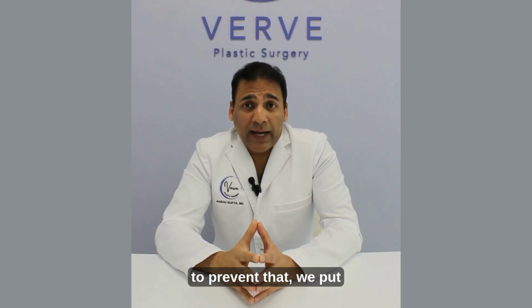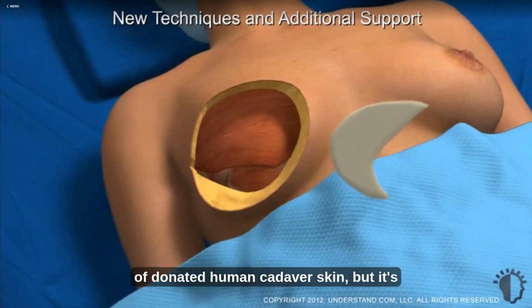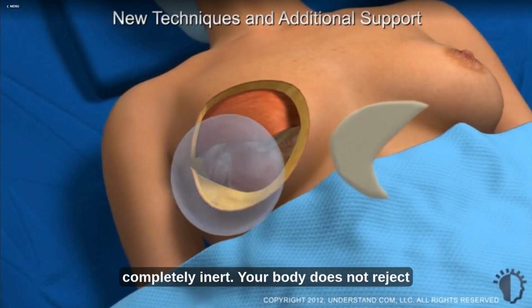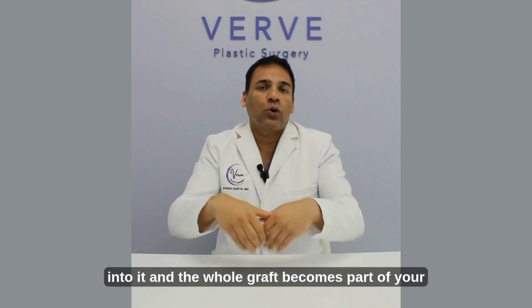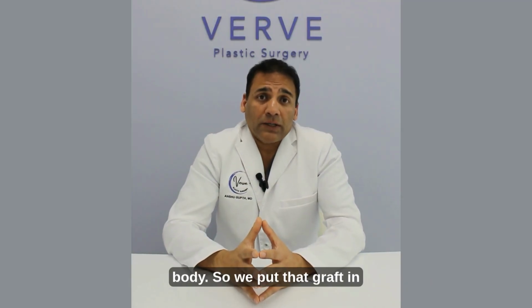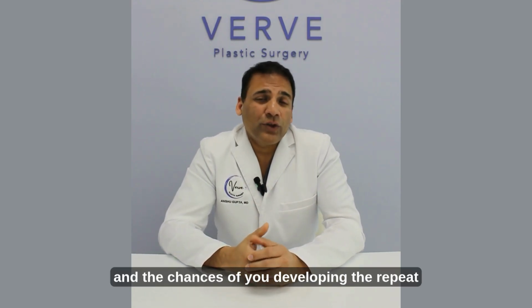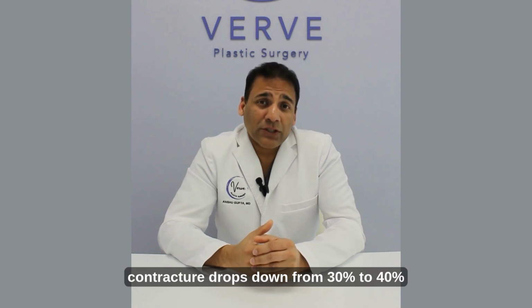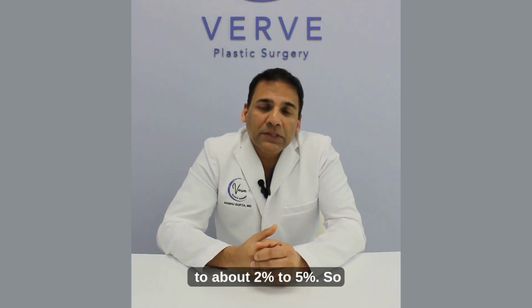So to prevent that, we put a small graft which is made of donated human cadaver skin, but it's completely inert. Your body does not reject it, and within 3 months your body grows into it and the whole graft becomes part of your body. So we put that graft in, and the chances of you developing the repeat contracture drop down from 30 to 40% to about 2 to 5%.